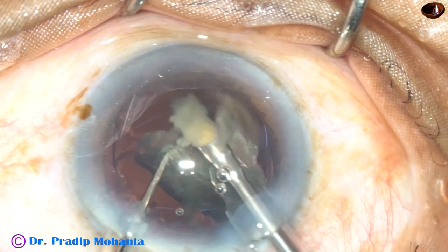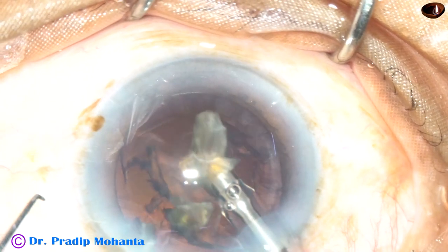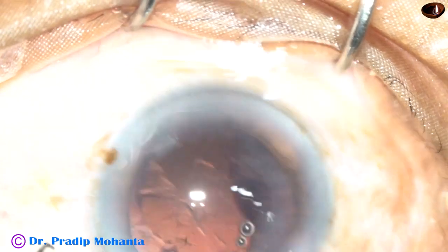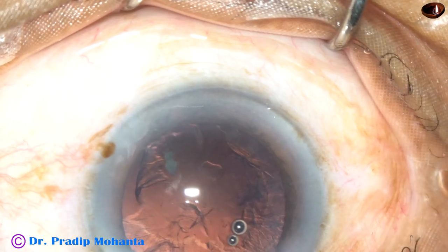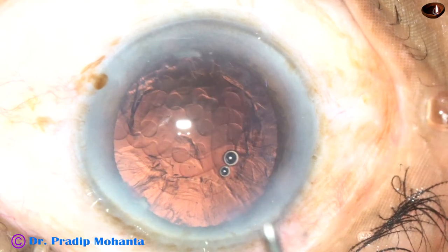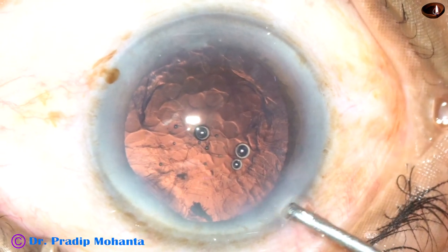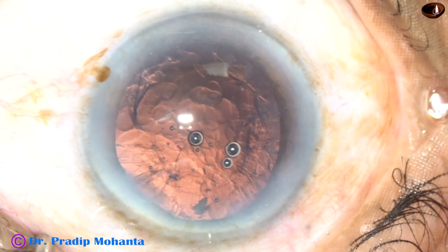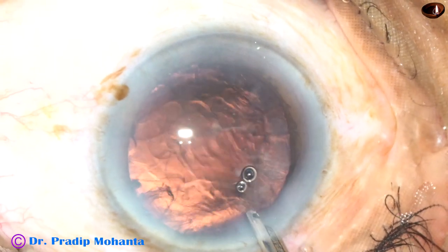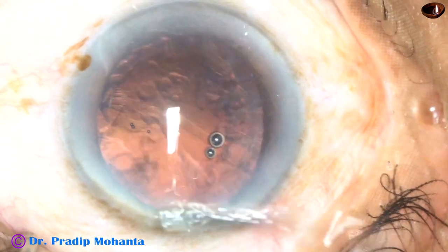This is the last portion of the nucleus. The chopper is removed and the anterior chamber becomes more stable. Now there are two small bits of nucleus. It is very easy to scoop out these bits of nucleus before using bi-manual IA by this Simcoe — just use very low vacuum and remove those small bits of nucleus.